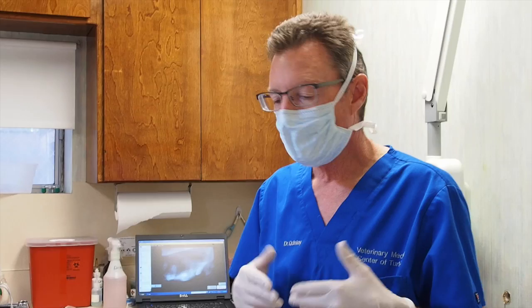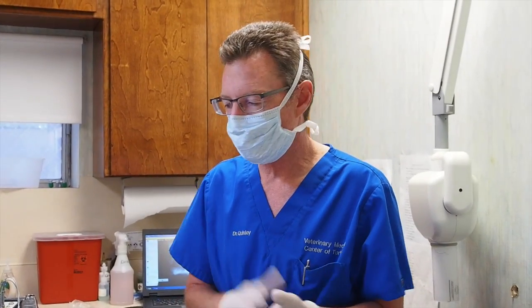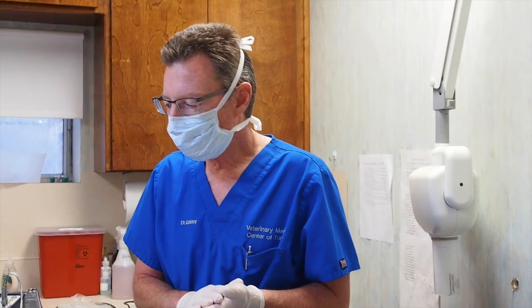and of course the basic cleaning and dental, we also polish the teeth, because that makes the tooth smooth. The little micro etches that are left on the tooth surface, the enamel surface, will actually collect plaque and tartar much more easily, so we smooth them. It's not to give them a bright, shiny, white smile. There's actually a reason for it. Then we flush the mouth out. So that's the basic procedure in the dental for his fractured tooth.